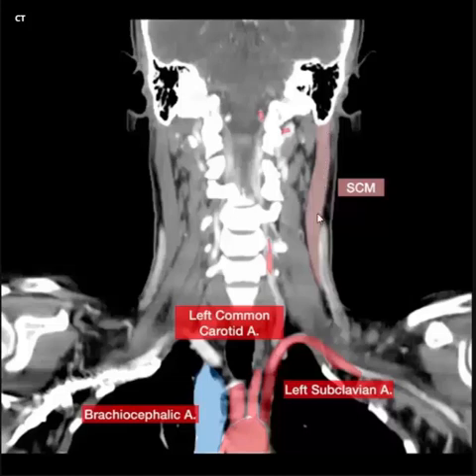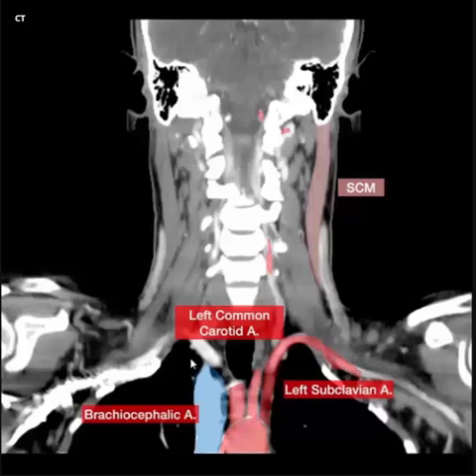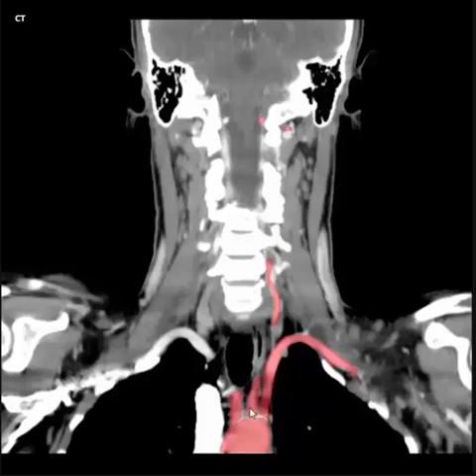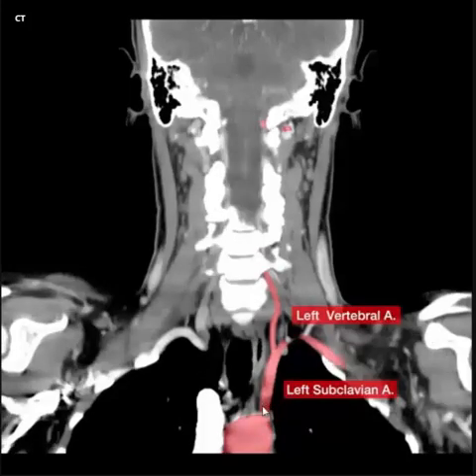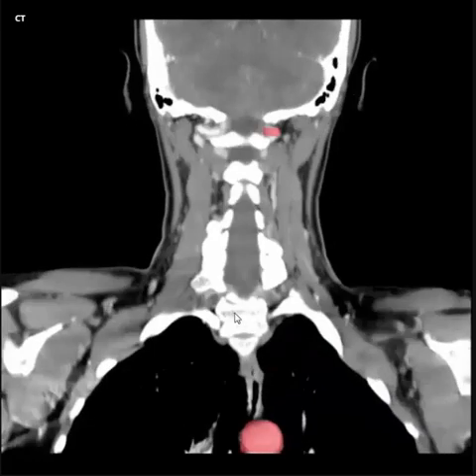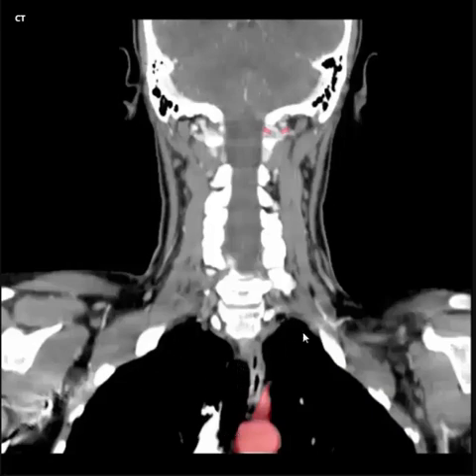Right and left sternocleidomastoid muscle, right and left vertebral artery, brachiocephalic artery, left common carotid artery, left subclavian artery. Right and left apex.